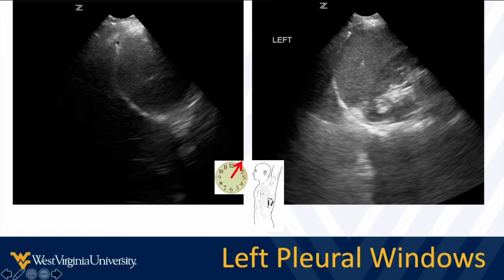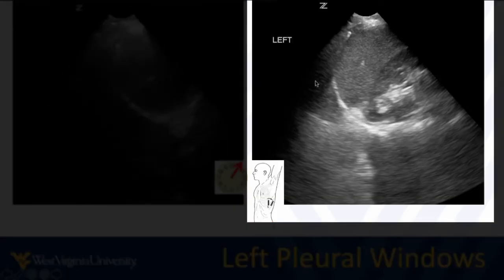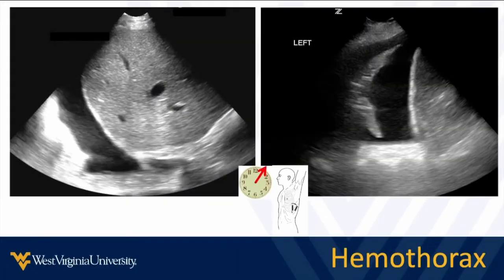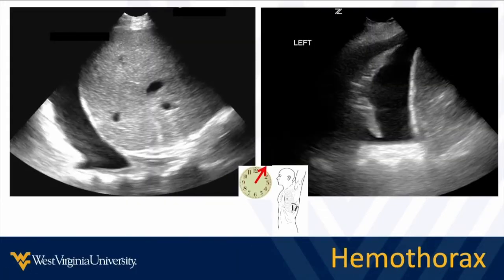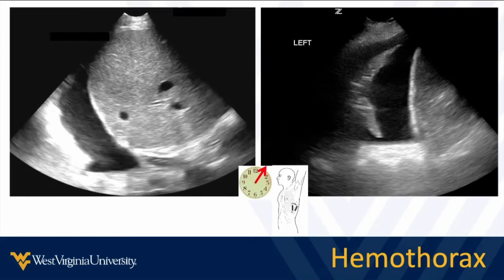So the diaphragm is one of our big landmarks here. We want to look above the diaphragm for fluid in the chest. We see the solid organ of the spleen. Again, we see that here. The bright white diaphragm, solid organ is the spleen. We can see spine shadows, kidney here. Remember, fluid is going to accumulate on the left side in this subdiaphragmatic space and then paracolic gutter. Fluid in the chest on the left looks about the same as fluid in the chest on the right. So we'll take a look at that. We look for it. Here's what it should look like.